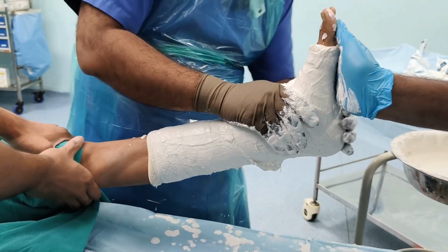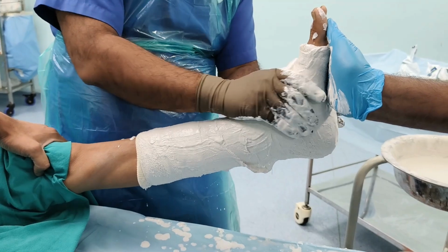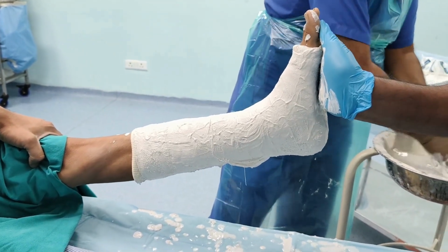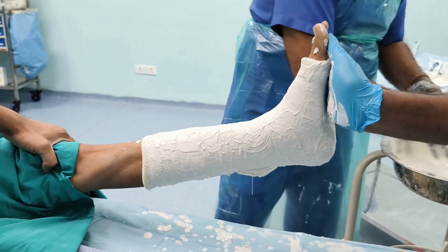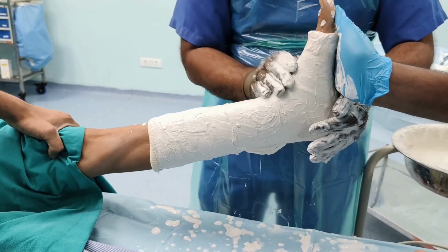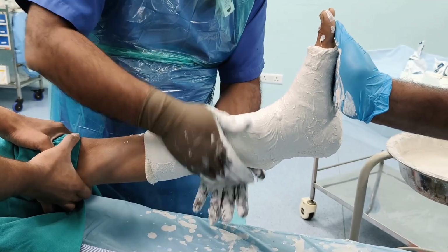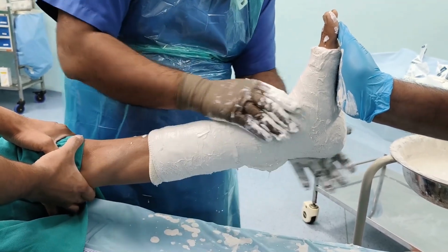Sometimes you will have lots and lots of excess POP, so you can just wash your hands with the water and again start the procedure. Continue smoothing it out with your hands. Don't press your fingers inside the plaster.